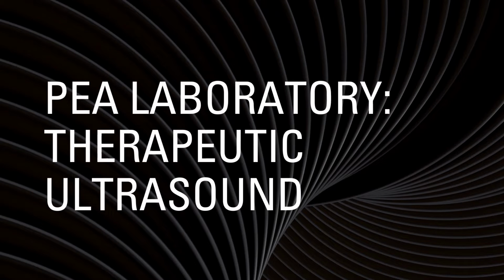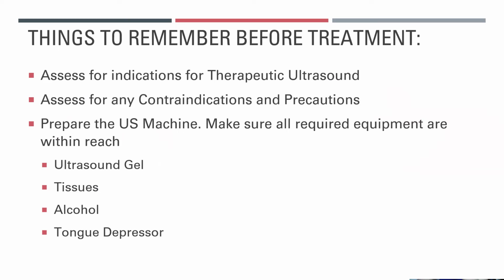Okay, so our topic for today is the application of therapeutic ultrasound to our patients. For things to remember before the treatment, we assess for the indications for therapeutic ultrasound first. This can either be muscle spasms or muscle tightness. Assess for any contraindications and precautions for ultrasound.